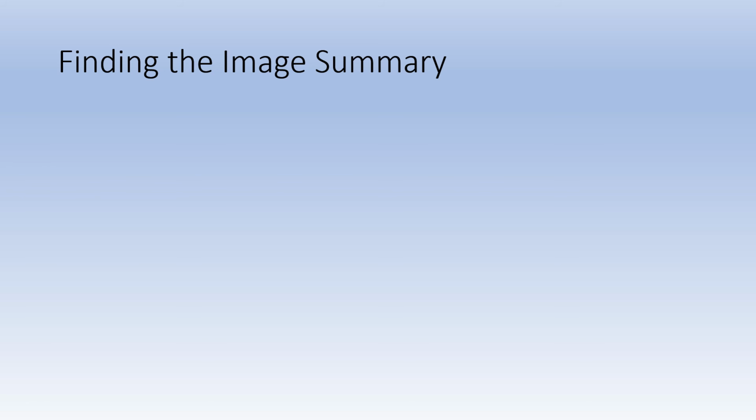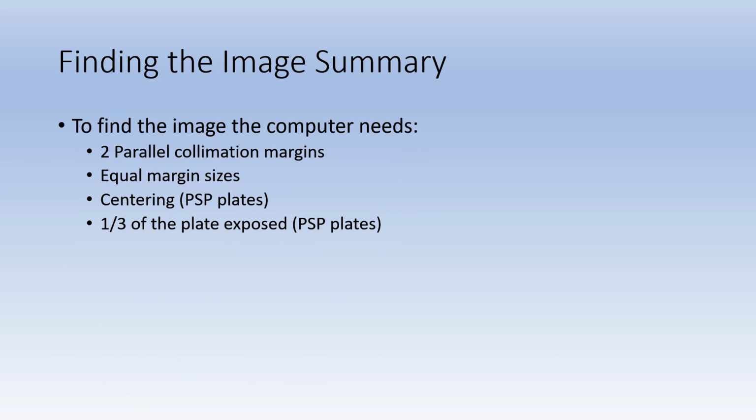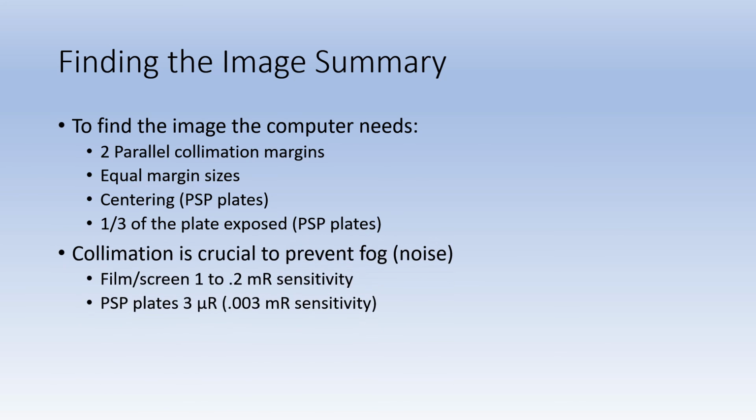To summarize, for a computer to find an image accurately, it needs parallel borders roughly equal in size. And if you are using a PSP system, consider plate size and coverage as important as well. Fog has a larger effect on digital systems because they are more sensitive to small amounts of radiation.